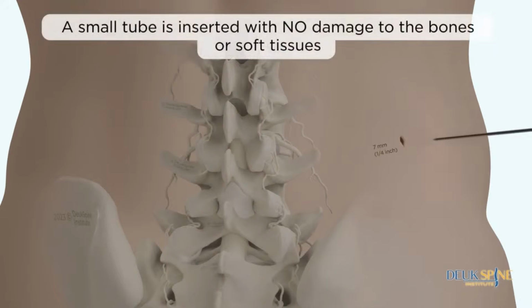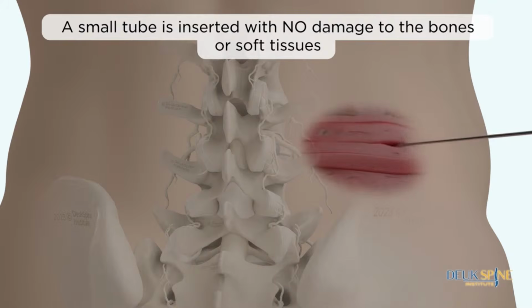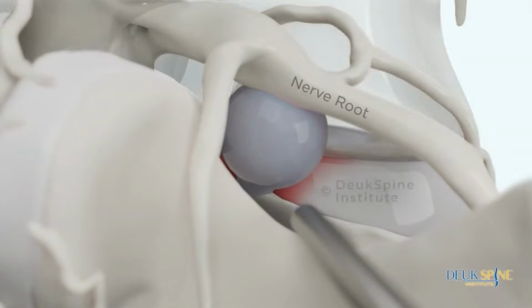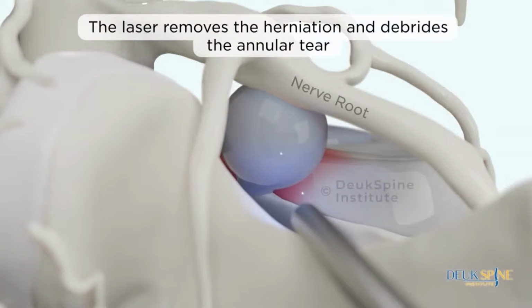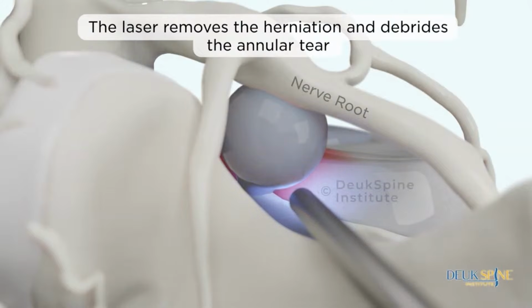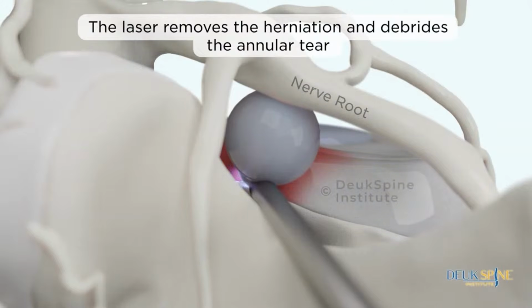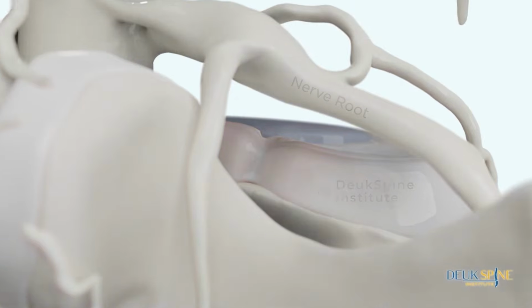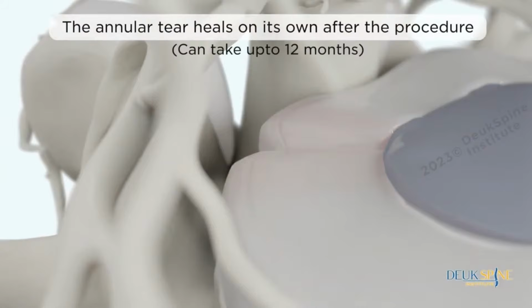A small tube is inserted with no damage to the bones or soft tissues. The laser removes the herniation and debrides the annular tear. The annular tear heals on its own after the procedure, which can take up to 12 months.